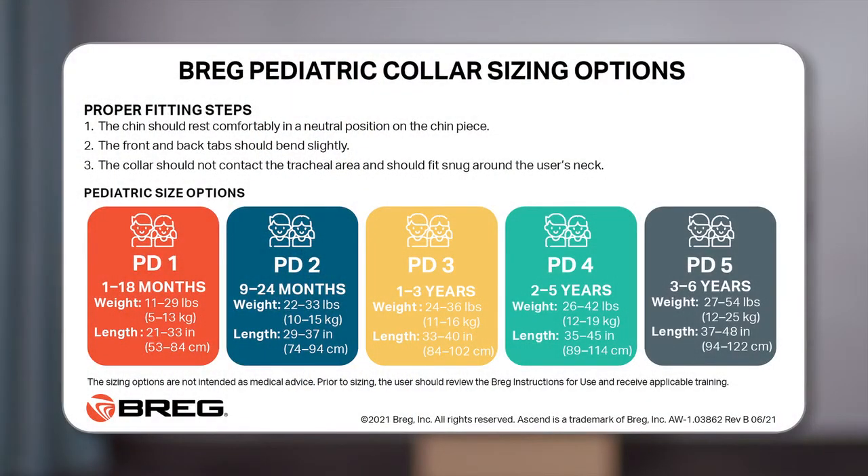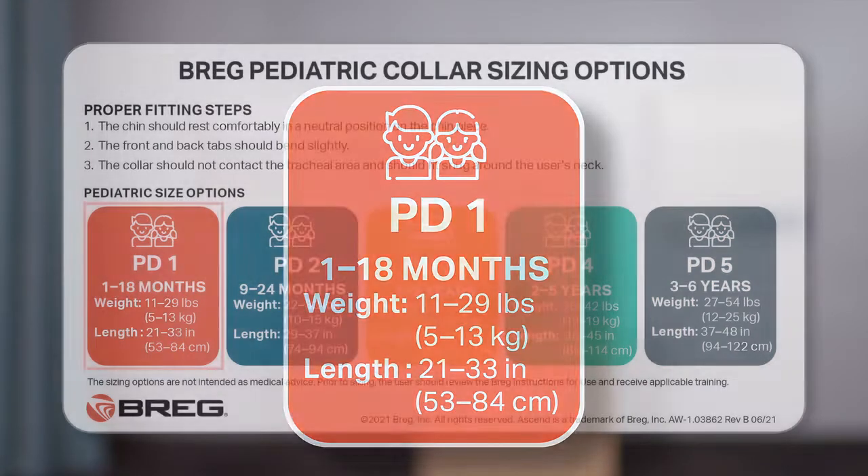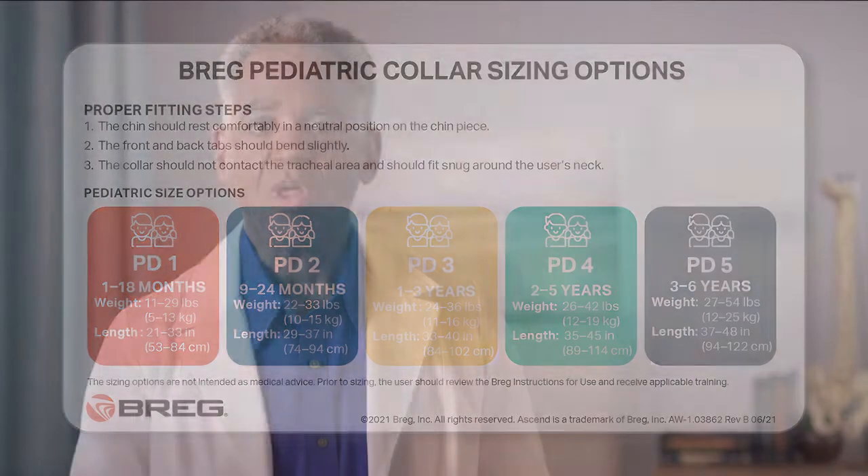For pediatric collars, you look at the back side of the sizing guide. You identify the child's age, weight, and length, and then choose the correct corresponding size based on those factors. In this video, we will only show the fitting process on the adult collars. The pediatric collar follows the exact same principles.